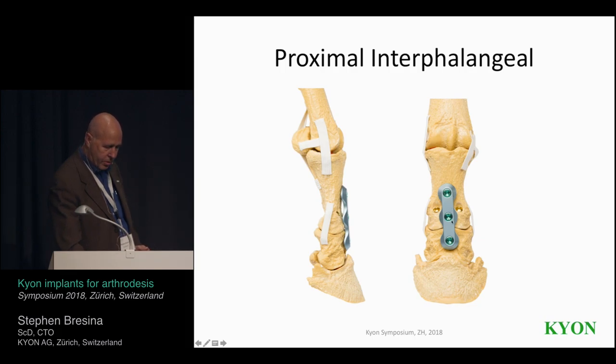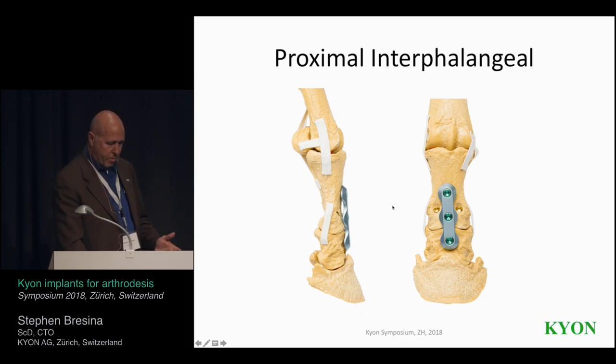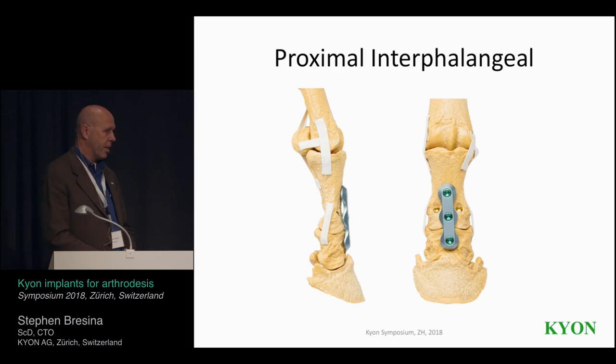So here's how it is implanted. These are the two 4.5 screws that are coming across here, across the joint, and the plate is put on there. And there's been a mechanical study that's been done. It's going to be published sometime in the near future, looking at this compared to a Synthes 4.5 broad plate. And it's favorable in terms of strength.